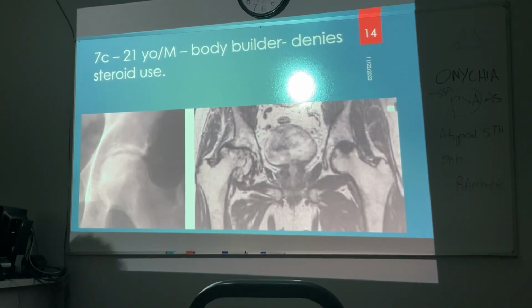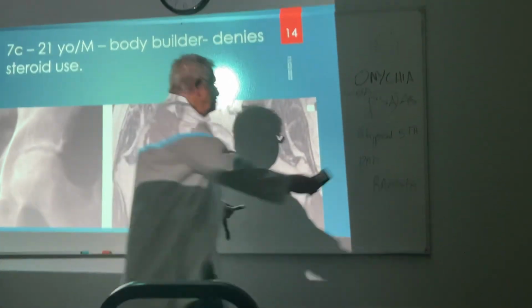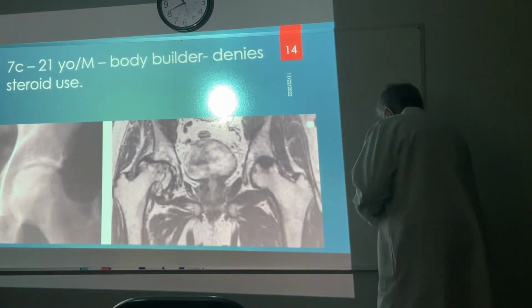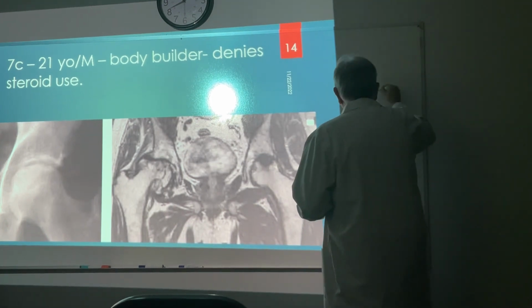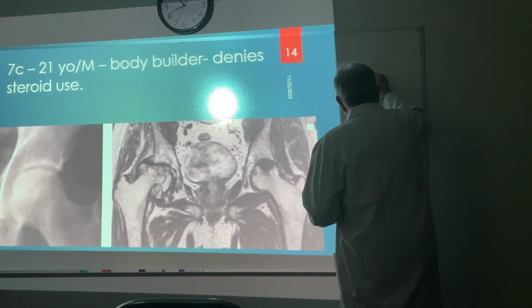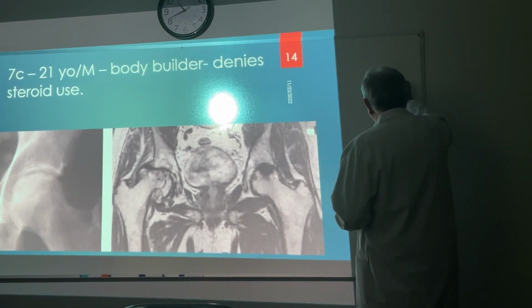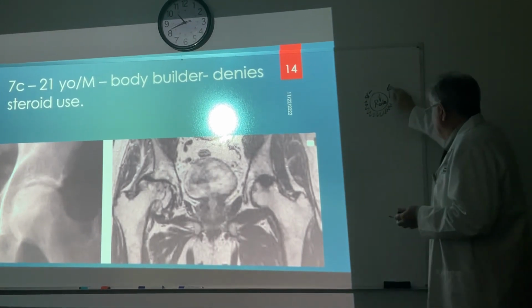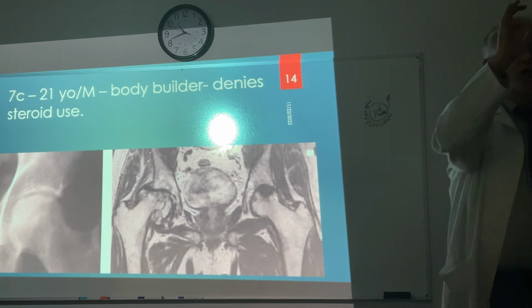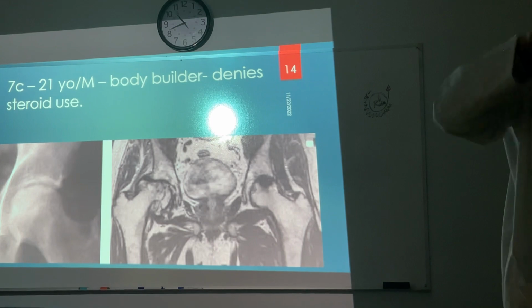In osteonecrosis, on MRI, something called a donut lesion. Okay, this is the rotten part of the apple. And then I have bone marrow edema all around it. So I have decreased signal intensity here, increased signal intensity around it. That edge between rotten and normal creates a ring, right? And that's called the donut lesion of osteonecrosis. Rotten on the inside, reactive bone around the outside.